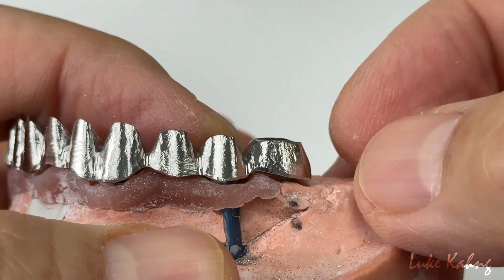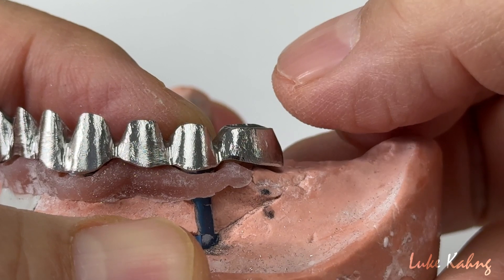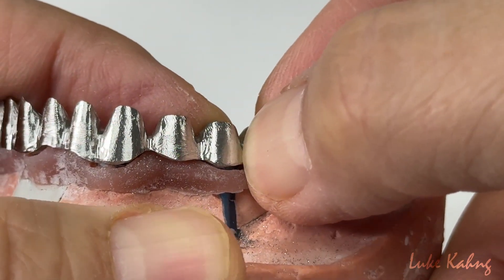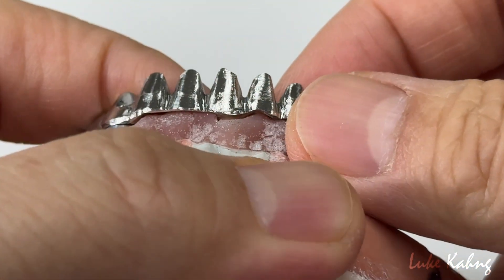And then this one, trying to grind more on this one so I can support the opposing teeth. So I have to stop it here — this is more, deeper. But underneath there is room.